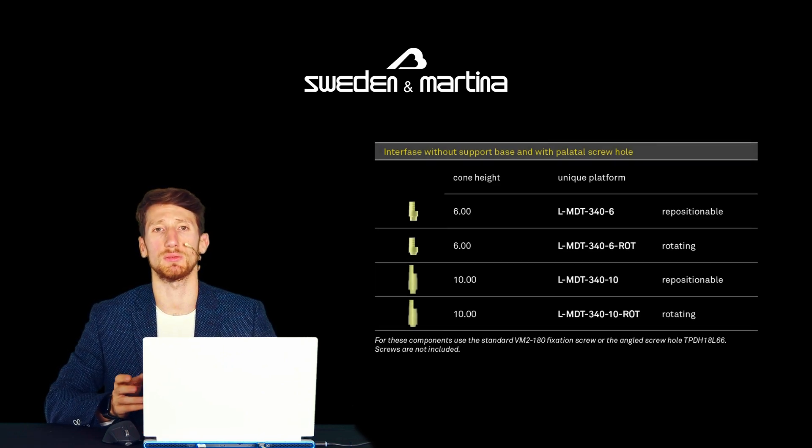If necessary, it's possible to cut two of the notches present on the surface to obtain a 4 mm cementation cone. It's also available a version with a 10 mm cementation cone that can be reduced to 8 mm. These components are sold without a screw.